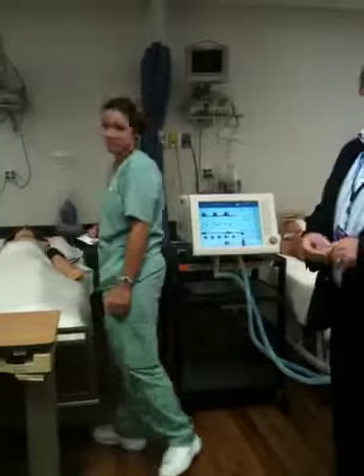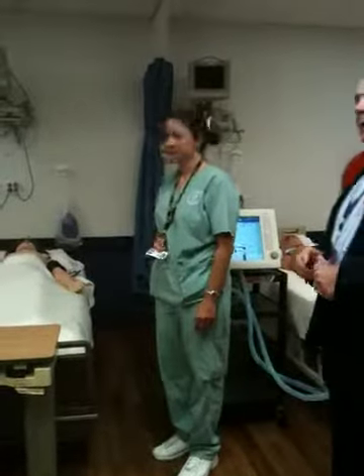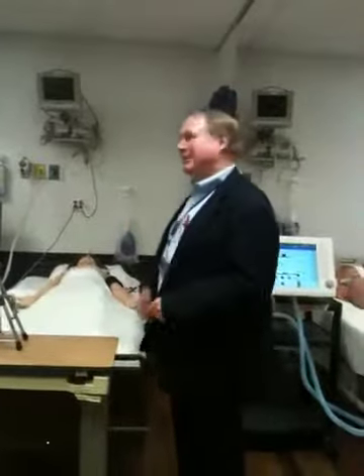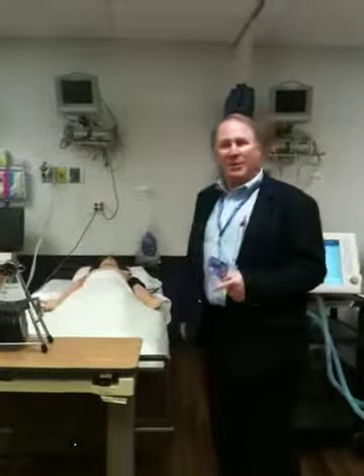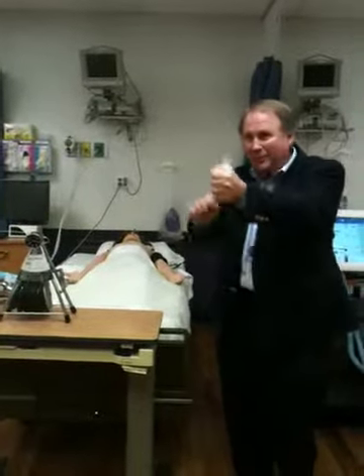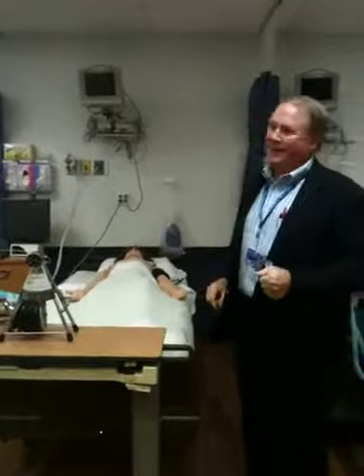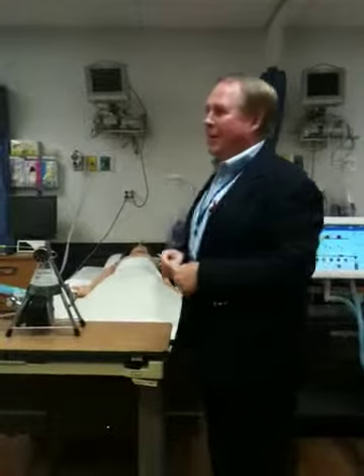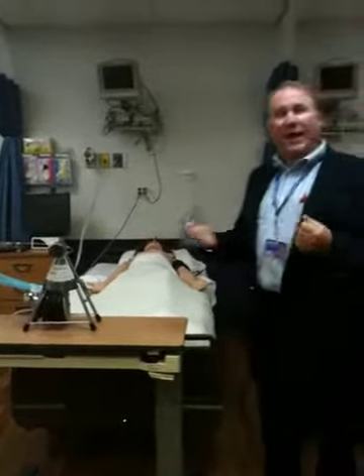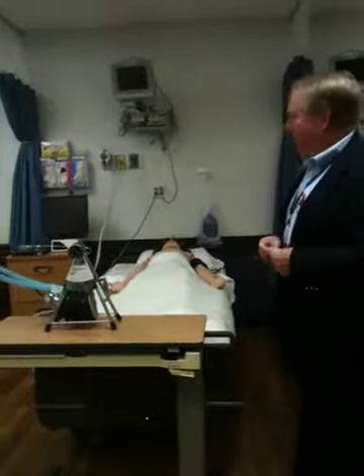These two here both talk. They bite. I can make them bite. So whenever the students start intubating and go to slide the tube in, down they go. You can also make their vocal cords close, so you're looking at them, ready to put the tube in, and all of a sudden the cords close. But they do talk to you. They have over 1,500 different cardiac arrhythmias that we can give them. They have breath sounds. They have bowel sounds.